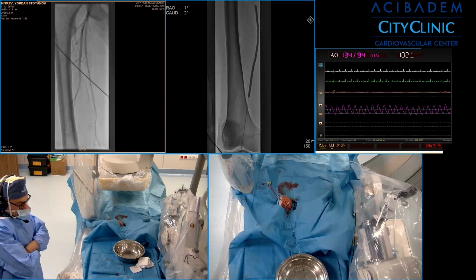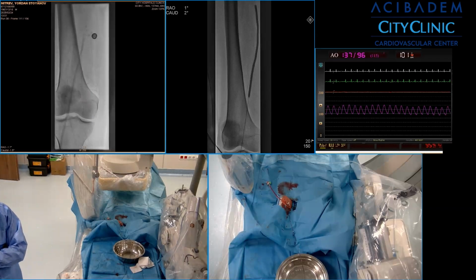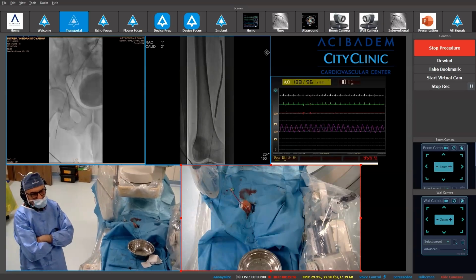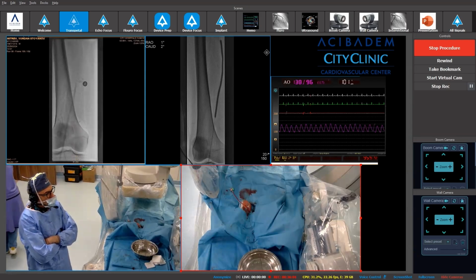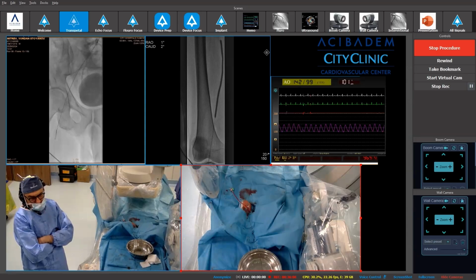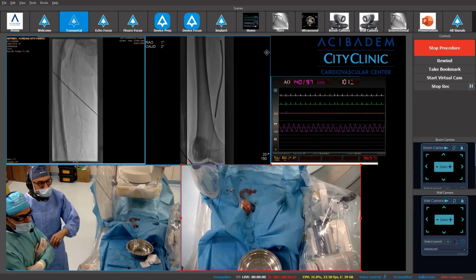For us cardiologists, it's quite difficult to wait. You're right. We are not very prone to wait, but in this situation, it's better to wait in order to avoid dissection and any other complications. And after that, we're waiting for the deflation of the balloon. Yeah. It's not easy.